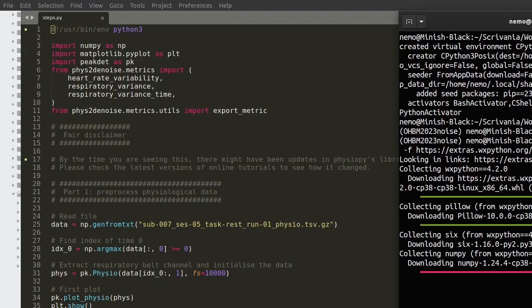So while we wait, the reason we decided to use PhysioPy's libraries for these tutorials, and all of the educational course, by the way, is based on PhysioPy or related software, is mainly the ease of installing this software, the fact that it is in Python, and that it is supported by a community. All of these decisions made us choose this software.